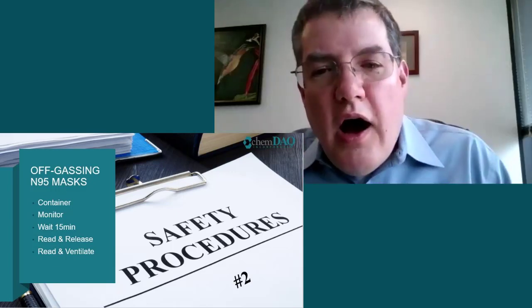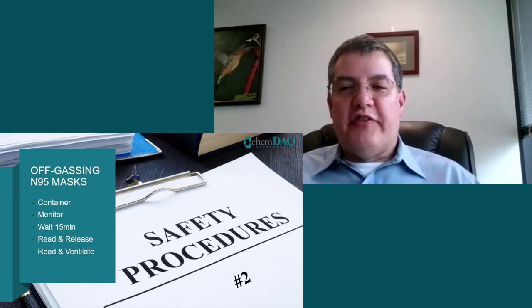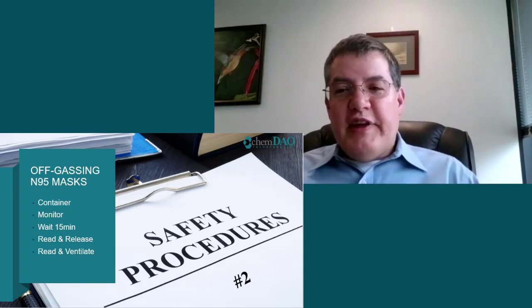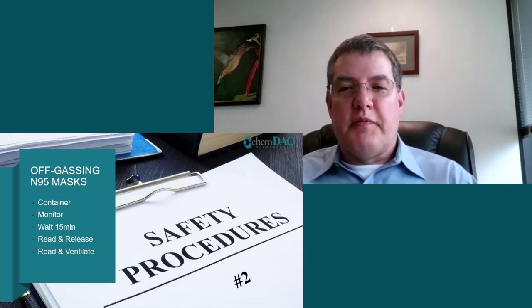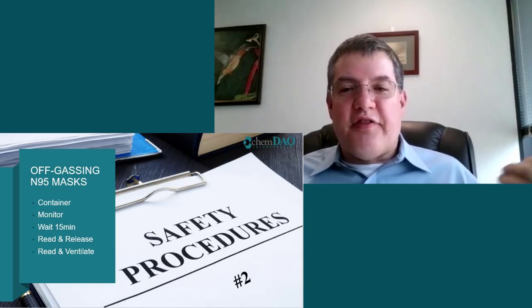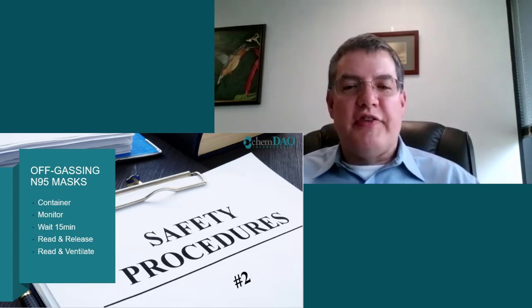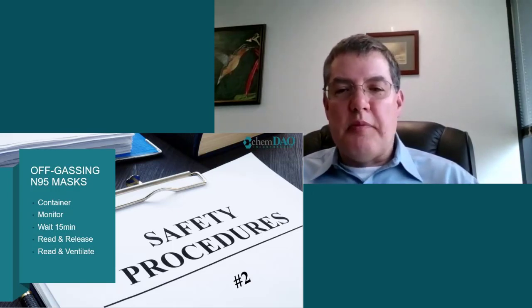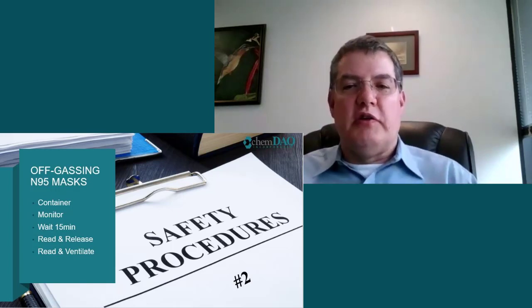Yes, sure. Off-gassing is the slow release of the sterilant gas after the sterilization cycle is over. If a steel object were sterilized, the sterilant gas would interact with the surface, kill the bugs, and when the gas is removed, the steel surface is left gas-free and there'll be no off-gassing. Now imagine that we were sterilizing a filter or other high surface area material that the gas would permeate through more slowly, getting into all the crevices and voids in the material.